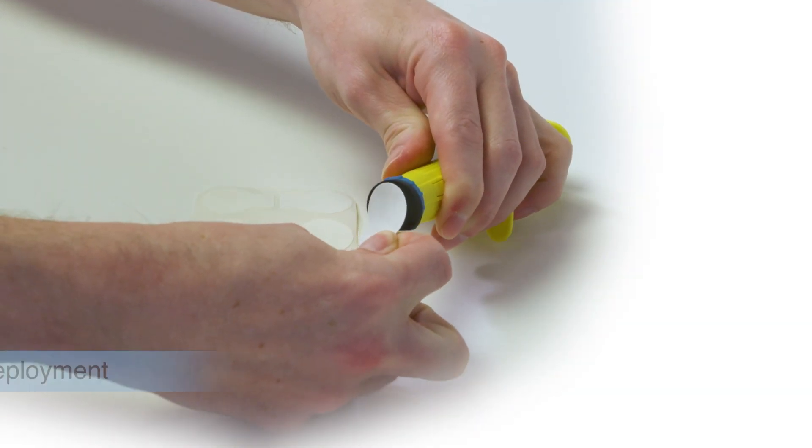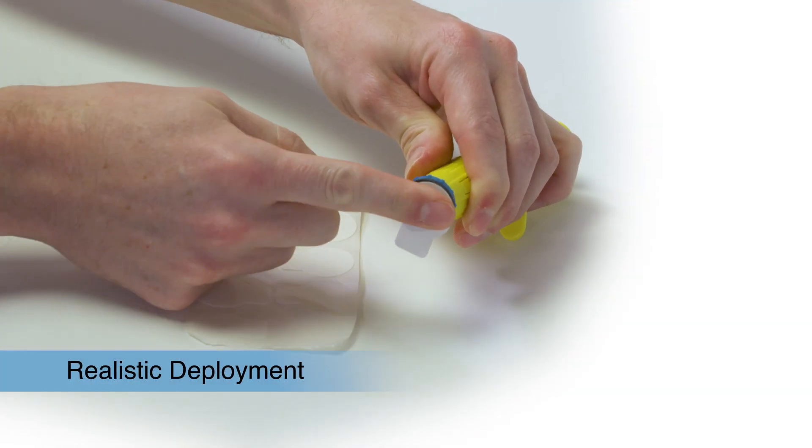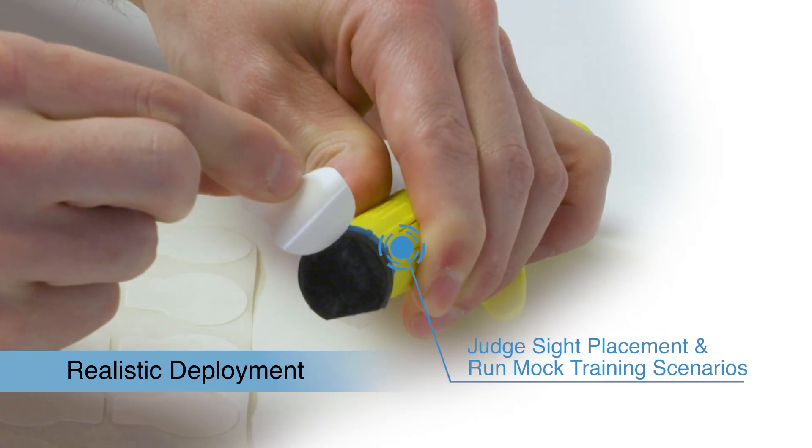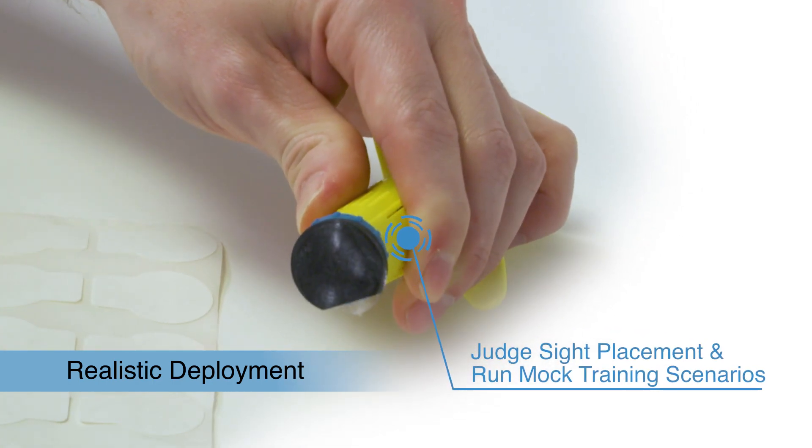Double-sided stickers allow for realistic deployments on both the tibia and humerus locations, giving trainers the ability to judge site placement and run mock training scenarios.